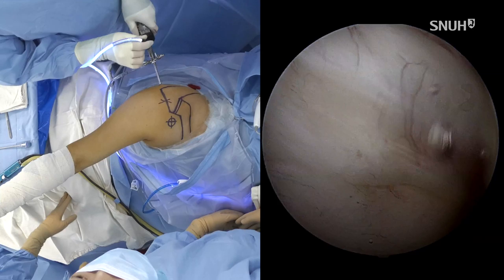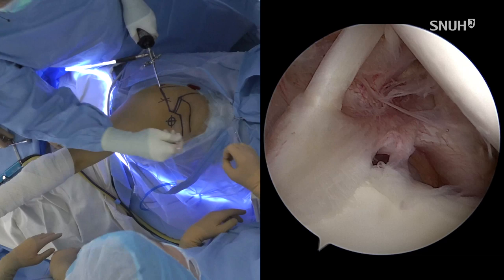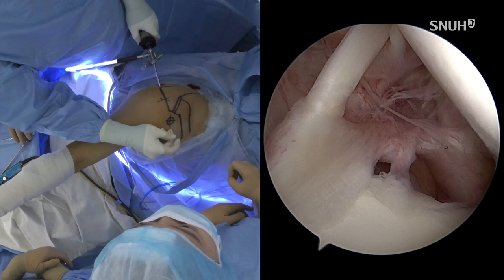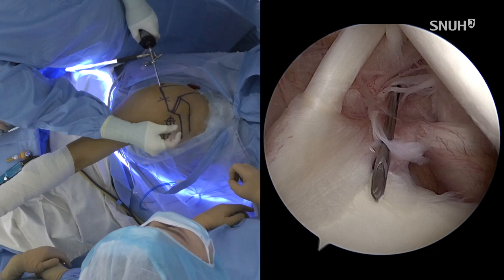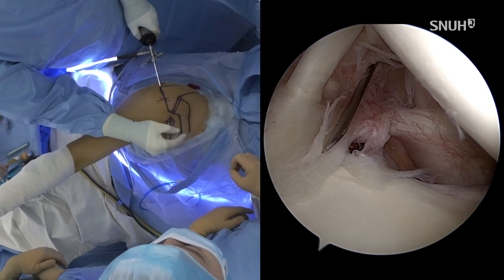This is a right shoulder from the posterior view with a 30 degree scope. I will make the anterior inferior accessory portal through the outside-in technique. For the Bankart repair, I will make the main working portal here, but for the SLAP lesions, I will do the transrotator cuff portal through here. At this moment, the anterior inferior is going to be the accessory working portal.